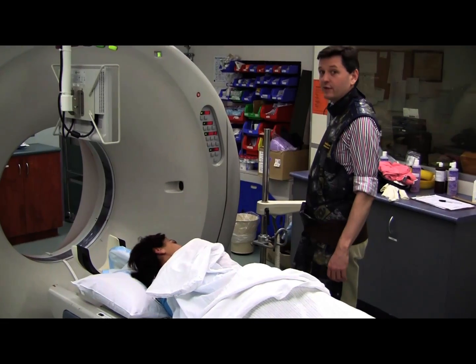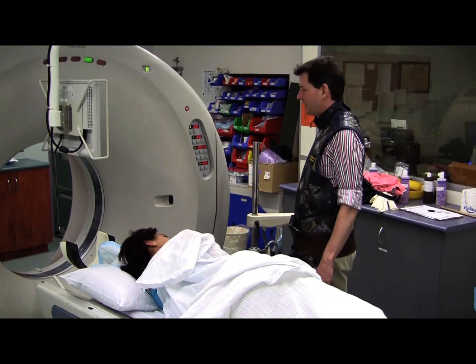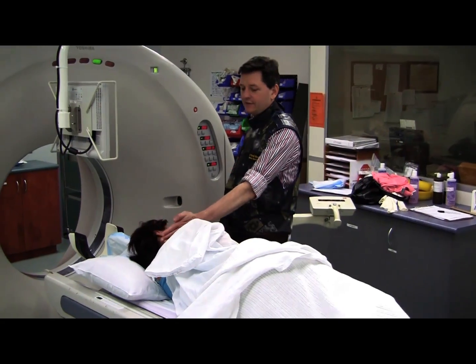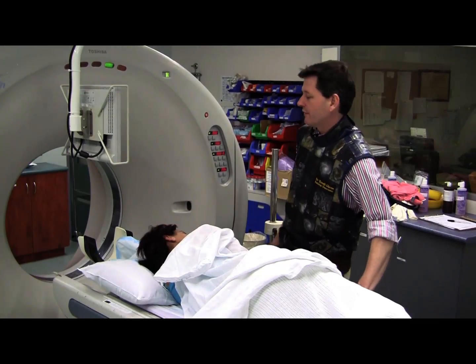For cervical nerve root injections, we normally have people lined up so that they're facing towards us. We're just placing the patient's neck roughly into the middle of the gantry. We know that C5-6 is going to be approximately there, but we'll move into position and then scope up and down and count down to be at the right level.